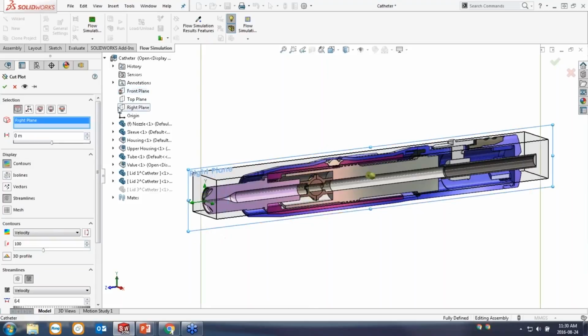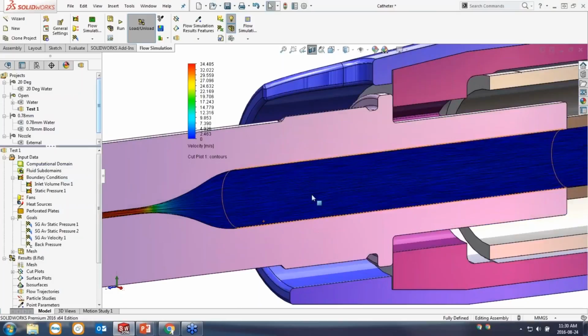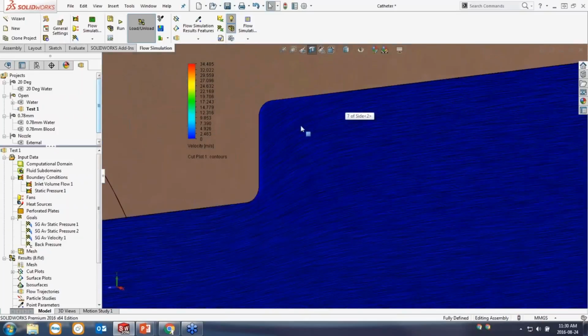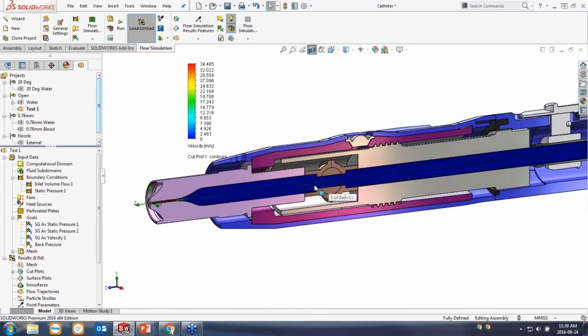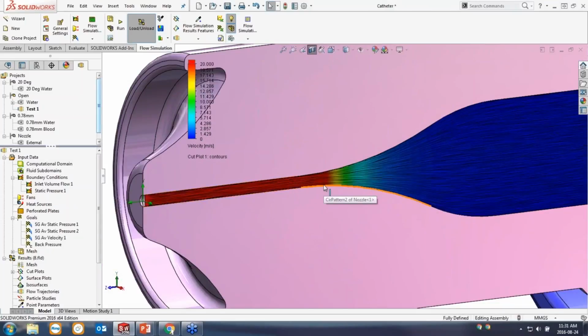And I'm just going to grab this on the right plane of the model and take a quick look. And as expected, the flow is very smooth and laminar throughout the entire straight tube. There's a little bit of a twist that needs to happen as it fits through the constriction of the valve. And we were concerned about areas that are traveling faster than 20 meters per second, so I'll type that in as the top, and we can see that this entire nozzle region is moving too fast.